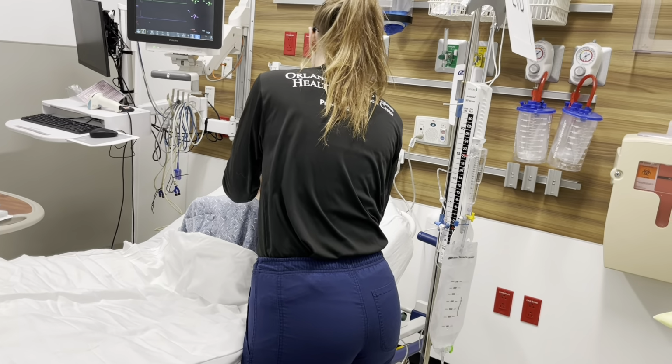And while you're doing all this, again, you can always educate your patient. They may still be asleep from anesthesia. If they're not asleep from anesthesia, let them know what you're doing, so that way they're cooperating with you, and you're not just kind of poking around with them and they're like, what are you doing?